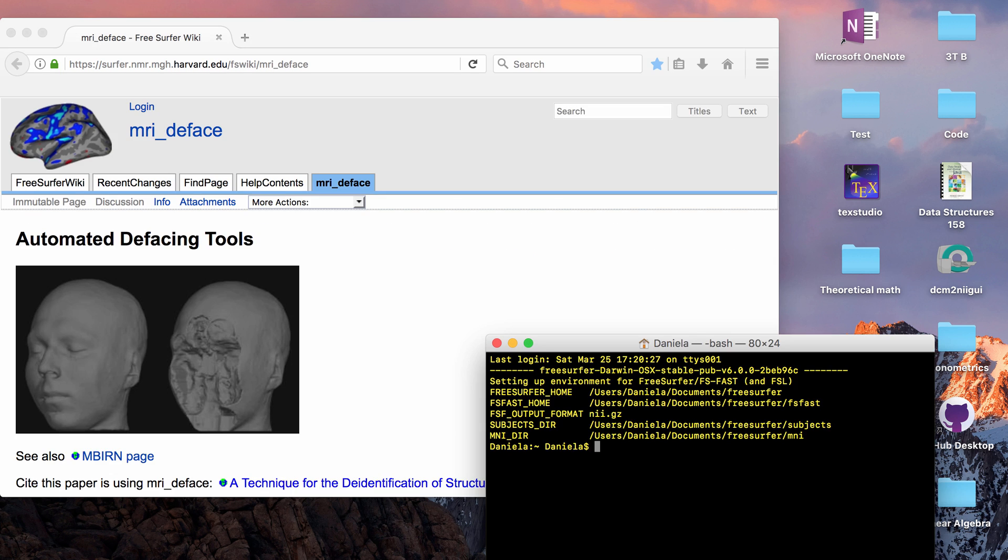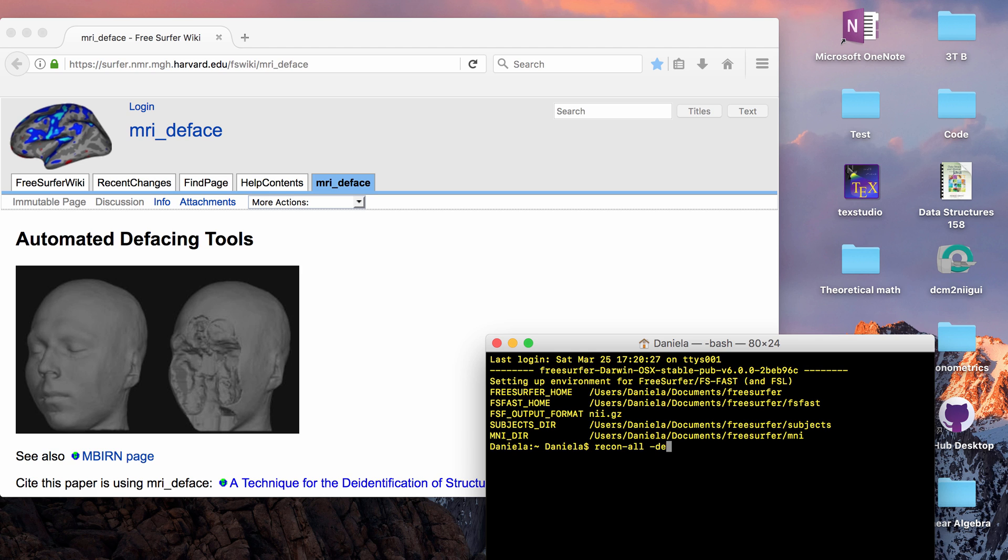So if you want to deface your data and you just want to run this function and nothing else, you can call the function directly or also if you are processing a subject for the first time as part of your ReconAll script or if you already have a subject in your subjects folder and you want to deface them, you can just add the tag deface and also the subject name and that will basically call the function and do the same thing.